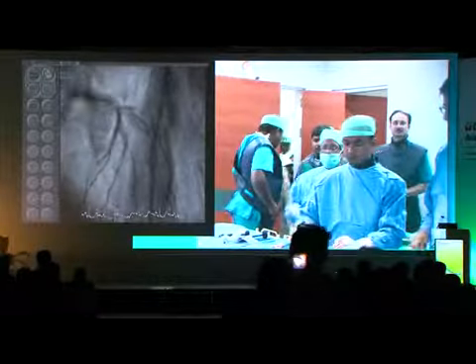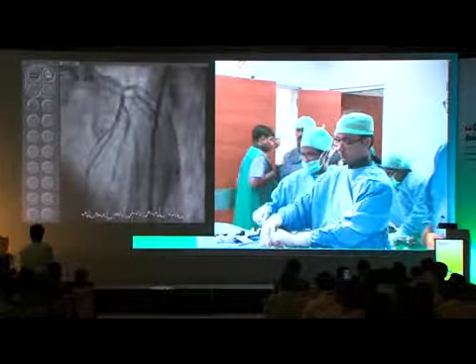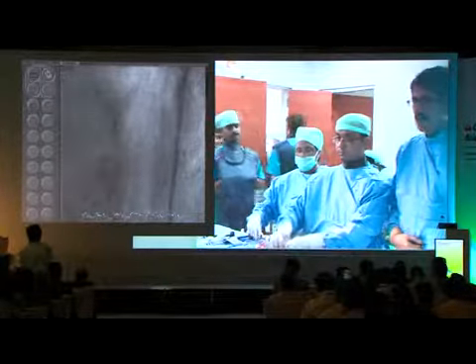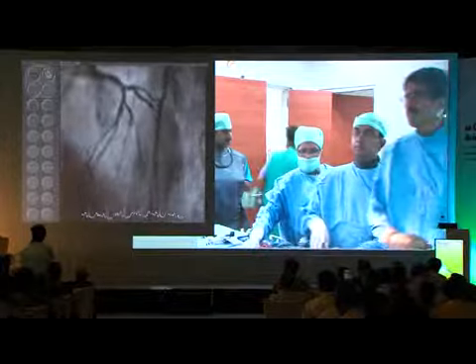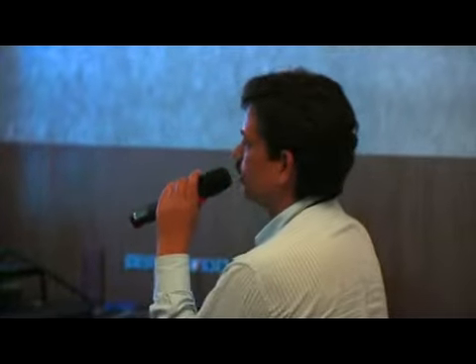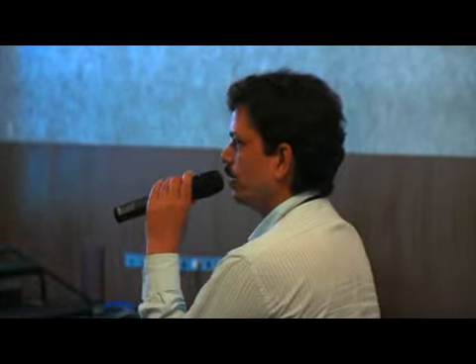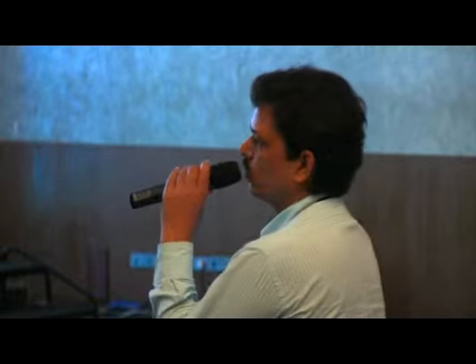I want to have just a final comment. What did we achieve after this angioplasty? We lost 4 lakh of rupees. Time is going to tell us. At least we lost 4 lakh of rupees, and IVUS is always an overestimation of the lesion. So I was guided on whether we should stent. We have given more stent load to the patient, more money load to the patient, and I think more complication follow-up.